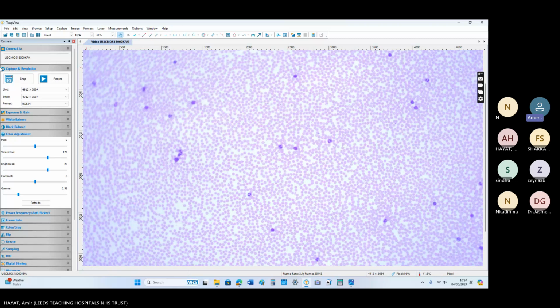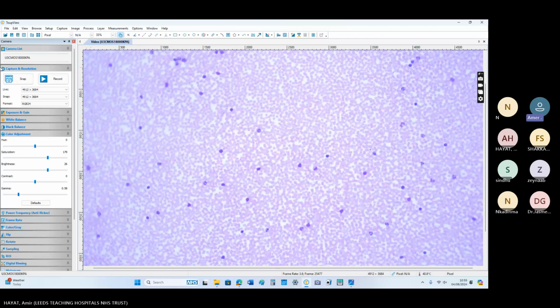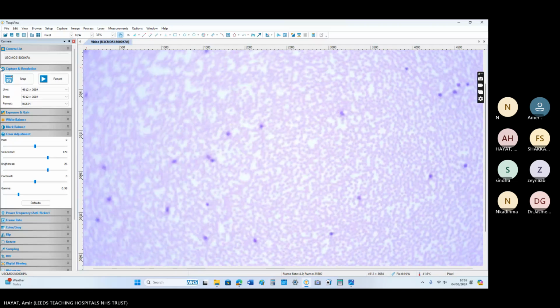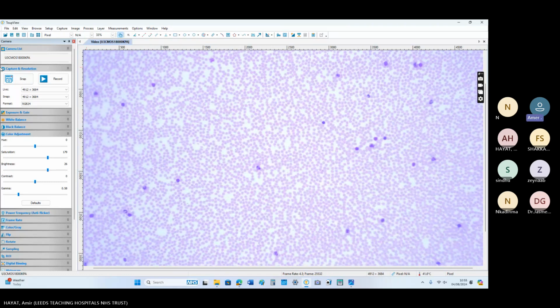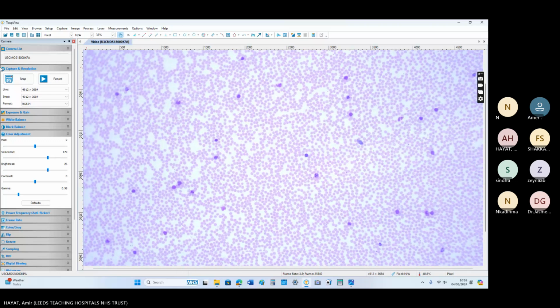Okay. So the last question, we have 8 minutes. This is a 45-year-old patient with refractory pruritus, not responding to anti-allergics, topical creams, and steroids. Anyone? The last case?